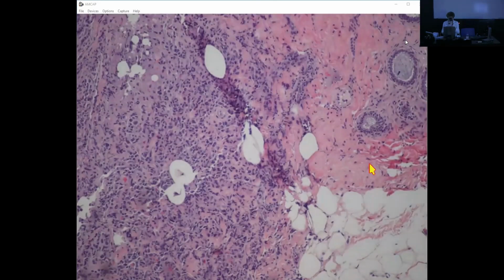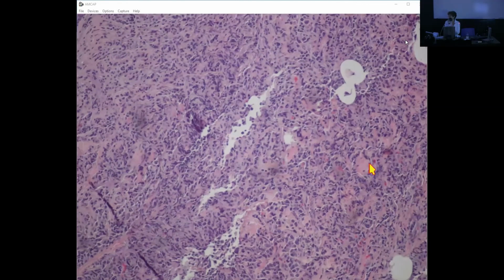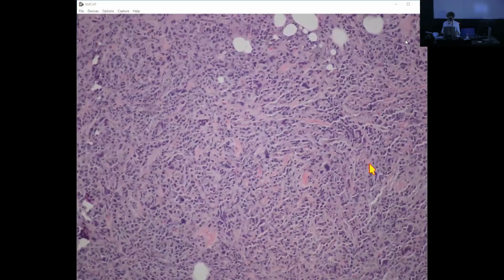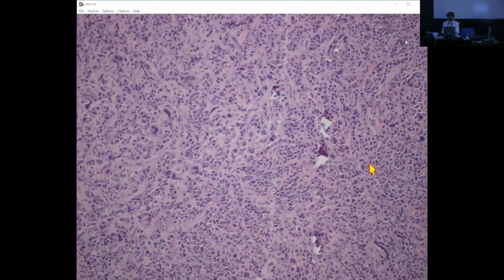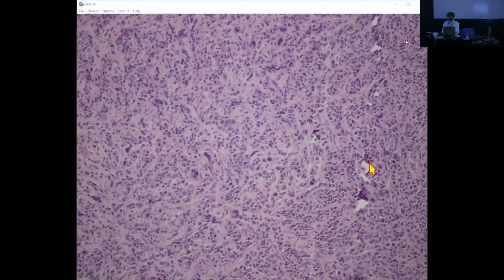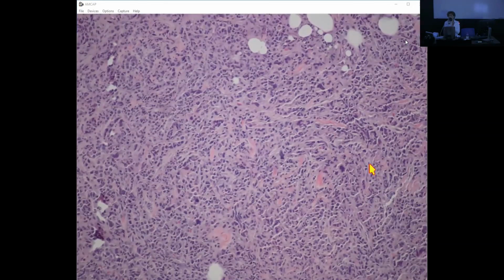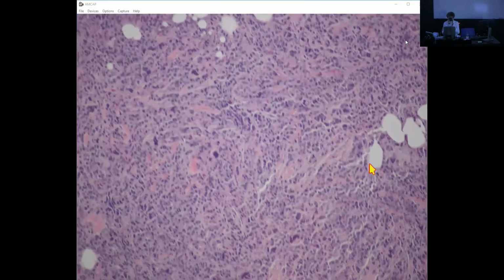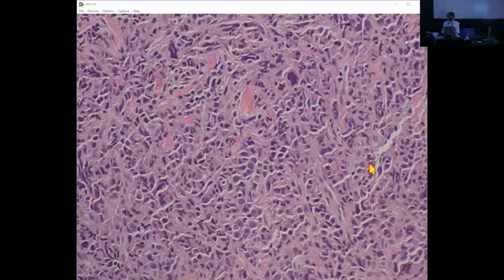And, you know, this case was initially diagnosed as invasive carcinoma, favor pleomorphic lobular. It's triple negative. It turns out that this patient had another lesion, a paraspinal lesion, which was biopsied. And I don't remember the details, but there was a question whether it was metastatic, right? Well, in the cytology specimen, it was biopsied by FNA. In the cytology specimen, the nuclear features were more evident.